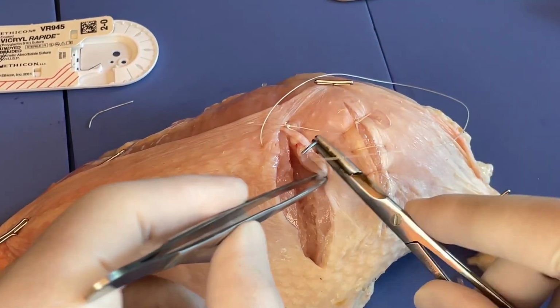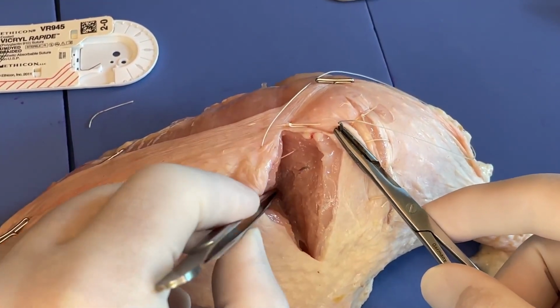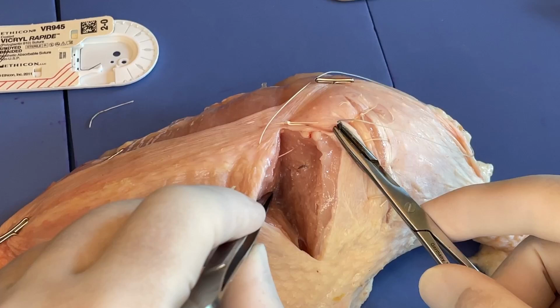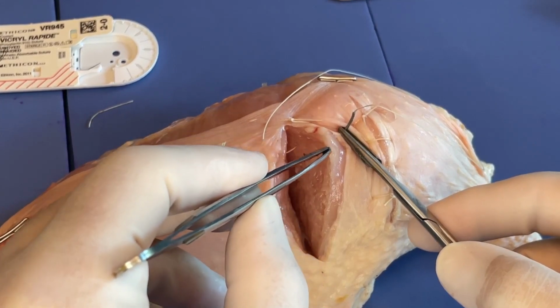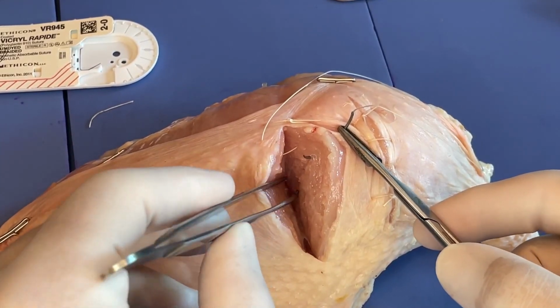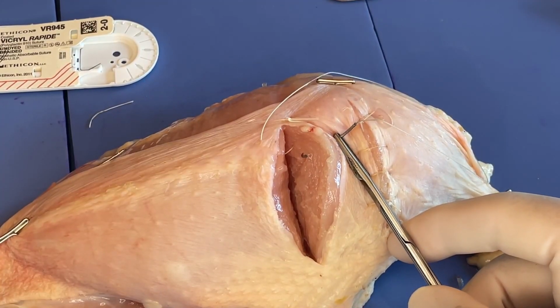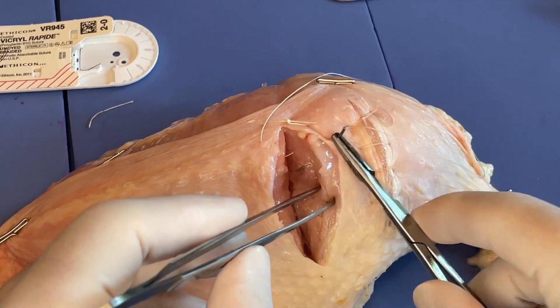Here we'll come out in the middle, say we've got a bigger gap here or it's really deep. Now we're also trying to get all the way down. You can see how deeply the tissue is divided down here. Again, any divided tissue, whether we've incised it or it's torn open because of laceration, you can see where my needle's coming out. So everything from my needle up is going to be contained within the compression area of the suture. But all of this tissue down here is not going to be contained. So there could be ongoing bleeding there, and it might not be as well reapproximated. So you could look at ongoing bleeding, potentially hematoma formation, potentially a bit of a gap there, where it's not going to heal as nicely.